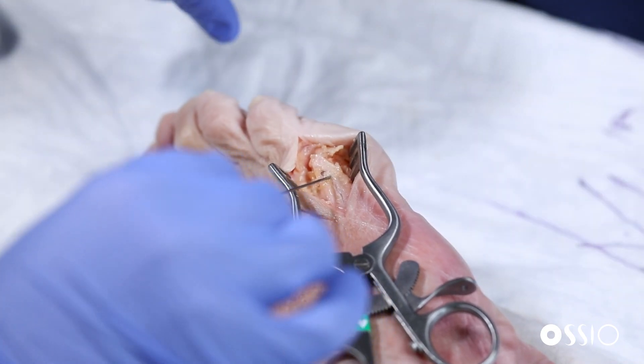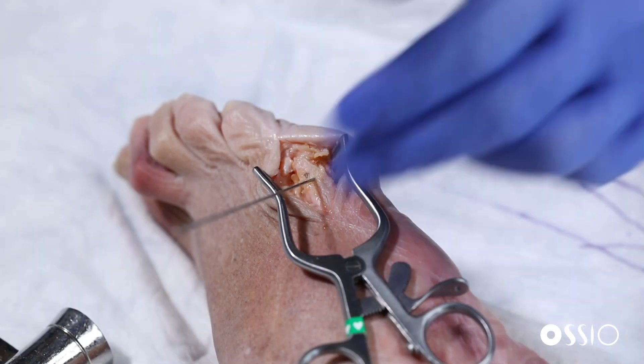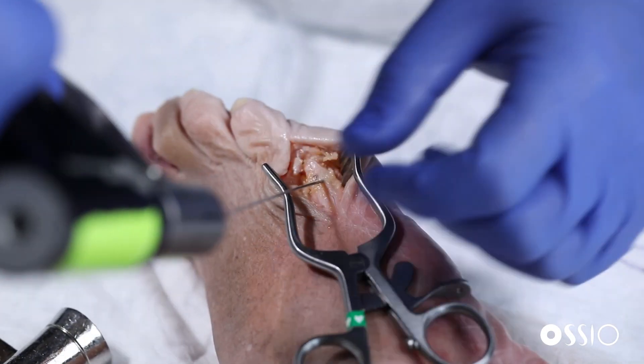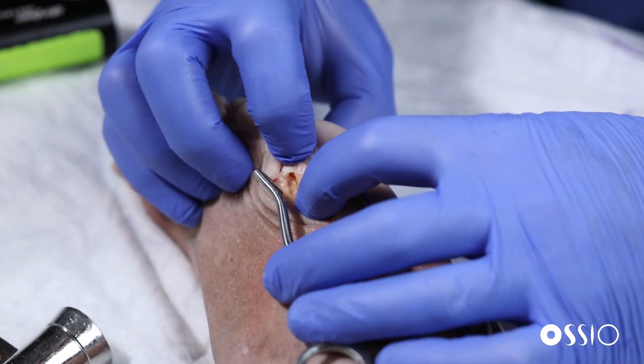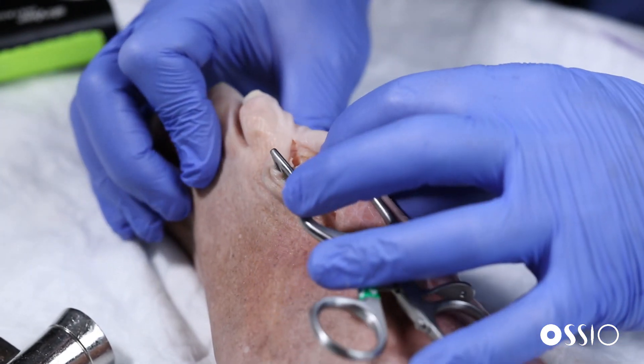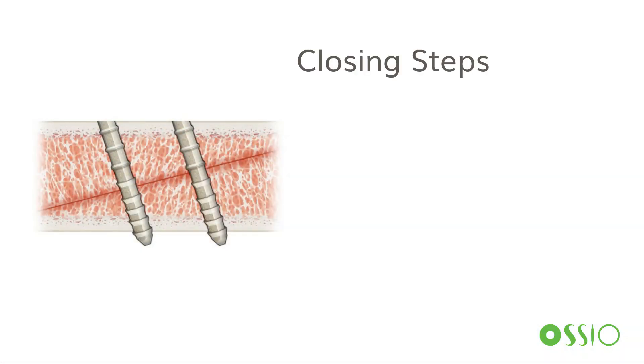In this case, we stressed the osteotomy and found that a single implant was very stable, so we didn't find the need for another implant — but that could have easily been done at the location of the second K-wire if desired. At this point, any redundant bone would be trimmed off.